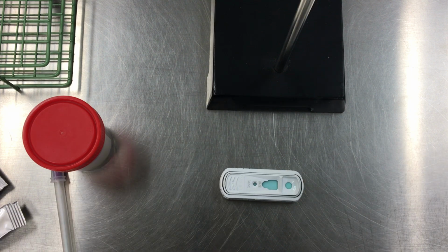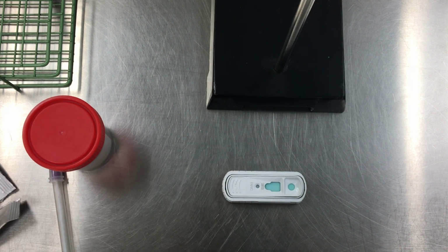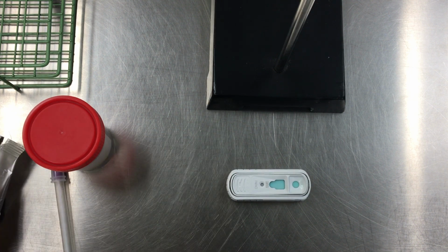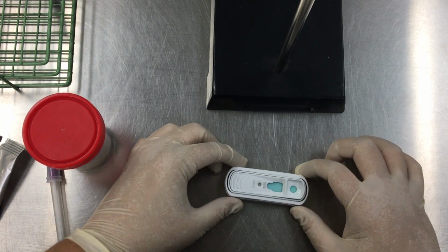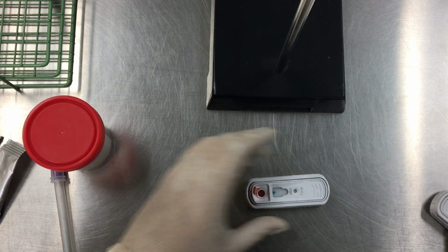And I'll consult the directions that come in the box of the tests to see how long I'm supposed to wait before I read the results. It's either going to be 8 or 10 minutes. And make sure to set a timer so that you read it at the right time. And the instructions that come in the box will also show you how to read results. And at the end of the given amount of time, you'll see blue dots show up in the window, similar to this test here.